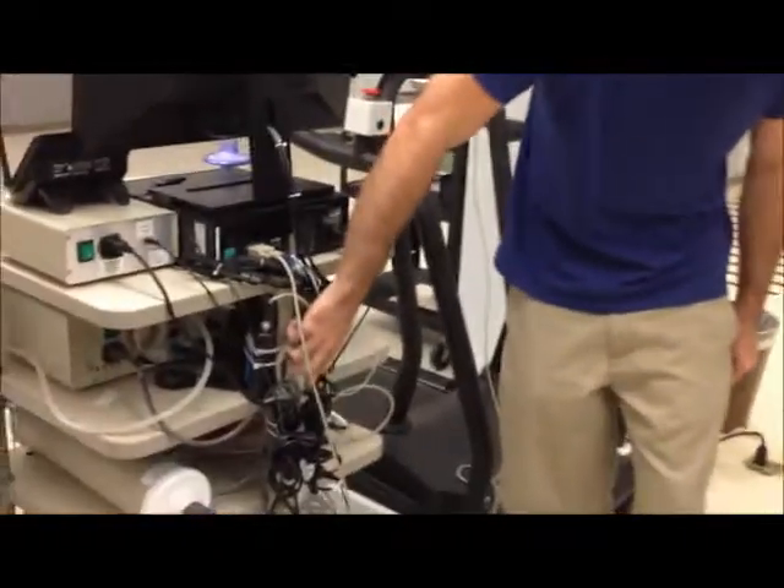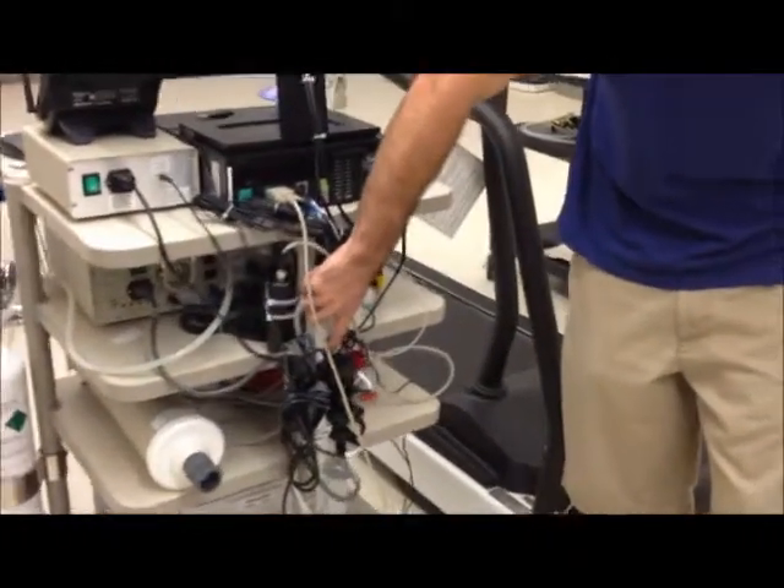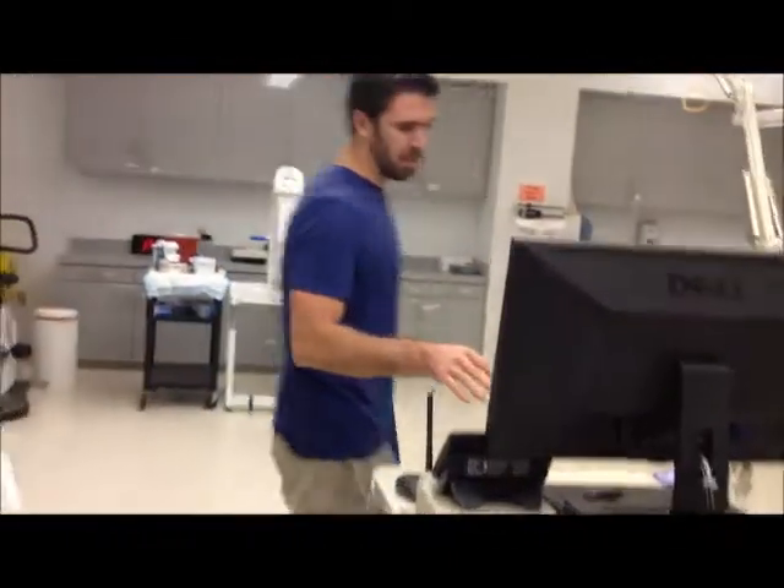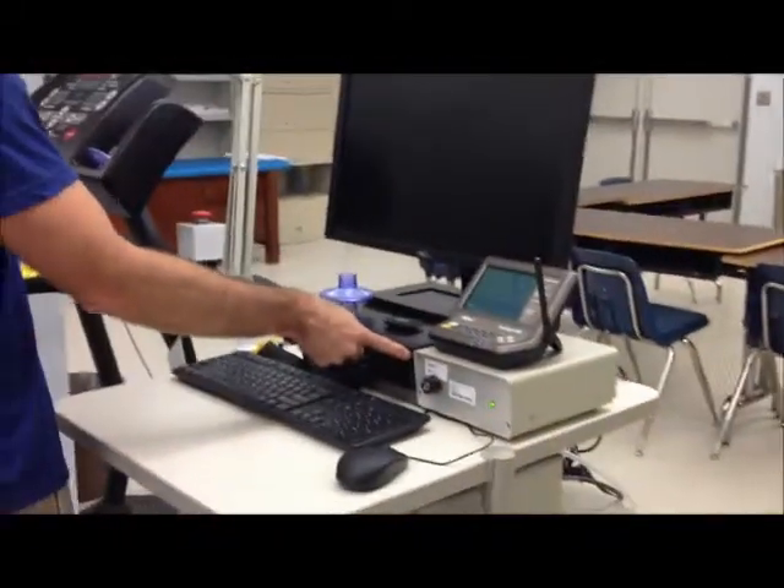Make sure the plug for the treadmill and the plug for the metabolic cart are plugged in fully. Once you have that figured out, switch on the back panel surge protector. This turns on all the equipment for the metabolic cart except for the computer, so you're going to have to come over here and get the switch for the power button for the computer.